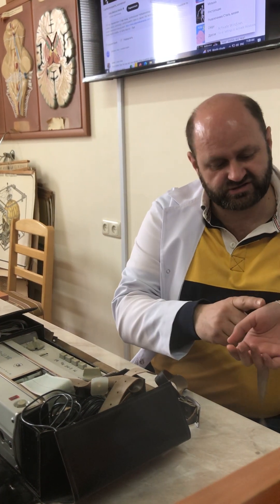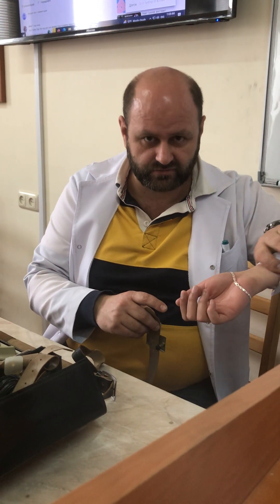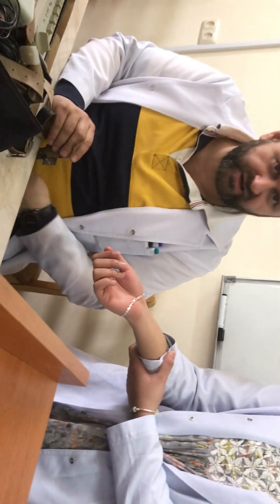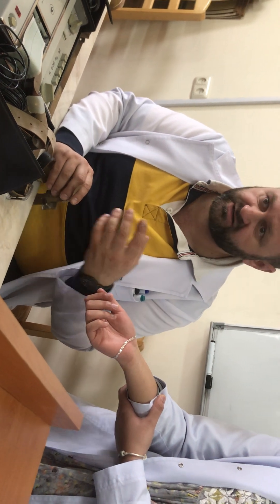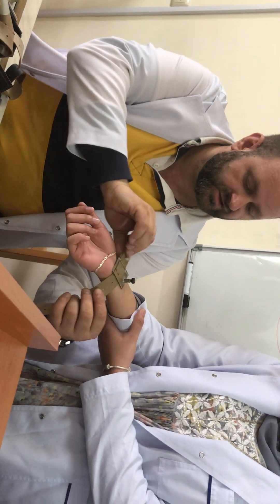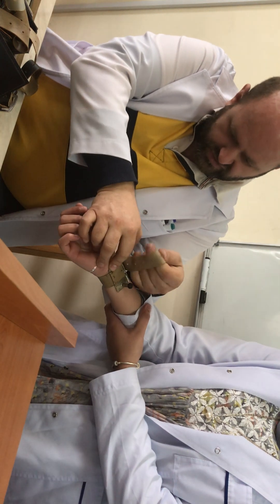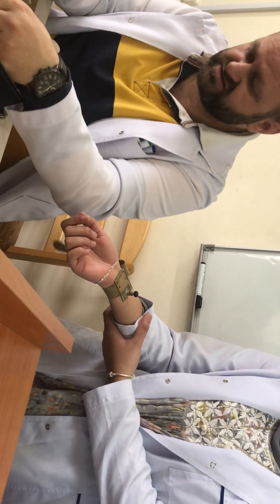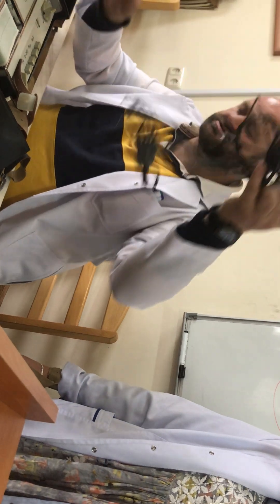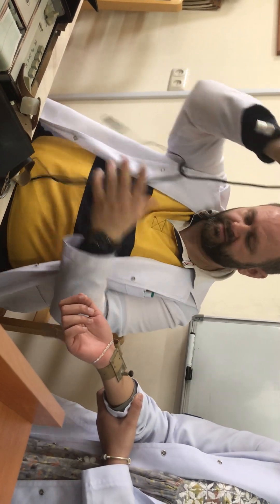For the registration, first of all every electronic or metallic device must be removed — belts and others — because every type of metal influences the electrical activity of the body. Then we use specific electrolytes placed under the electrodes and fix the electrode in place. The device has specific pathways and wires that connect it to complete the general registration.